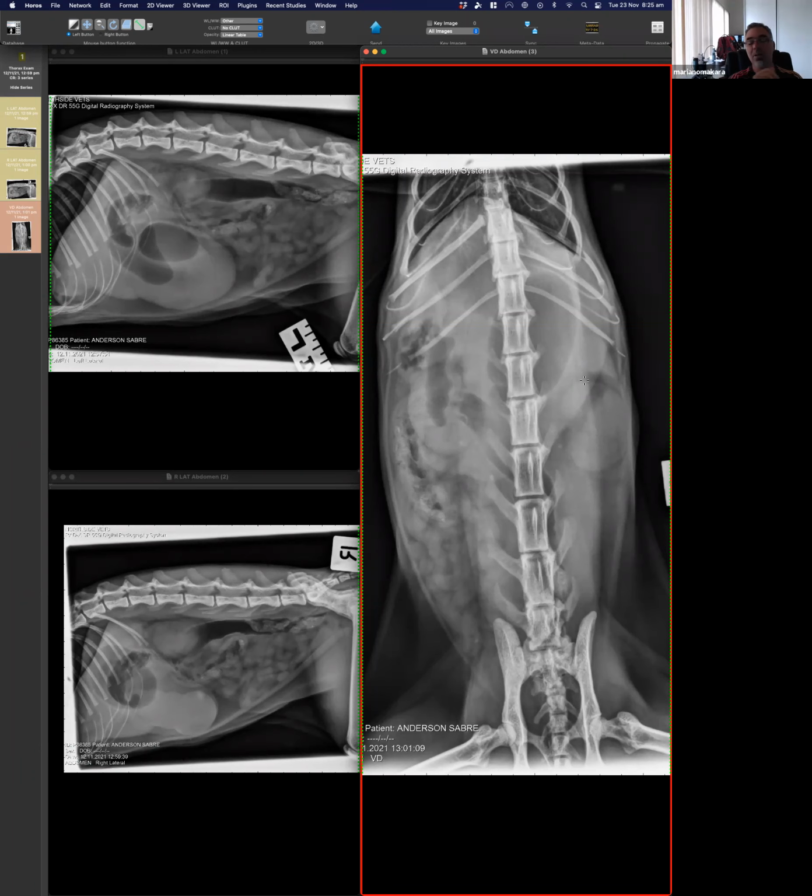Yeah, and the point again that I take is that it's an otherwise relatively thin animal, so that goes against expectation. I'm not saying your comment is silly. I'm saying your comment is perfectly fine because you are following the right clue. You are saying the animal is thin, so there is not so much subcutaneous fat, not so much fat on the spine, and the inguinal region is not that much. So now you're asking why there is so much detail. That's a perfectly fine thinking process. And then you get to the point where the only way to answer is that if there is gas. There is no gas, and therefore it has to be technique. Makes sense? Yeah. So that would be the sequence. You have to work through the process. Yeah. Okay, thanks.